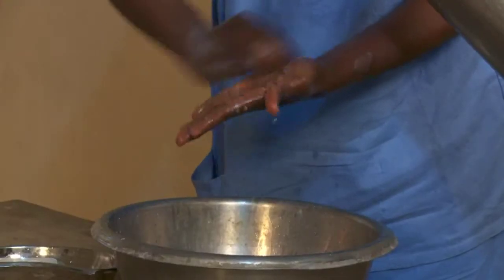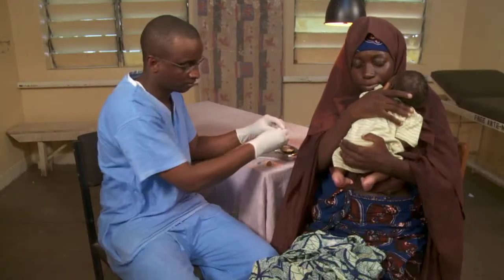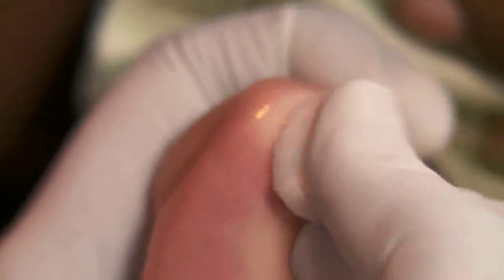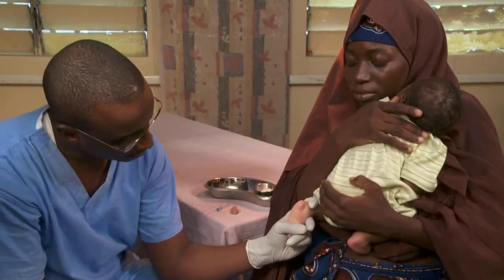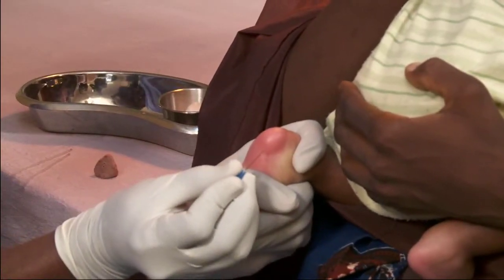Wash your hands and put on the gloves. Flex the foot upward and hold with one hand. Clean the skin on the sides of the heel. Allow it to dry. Squeeze the heel to make it flush red.